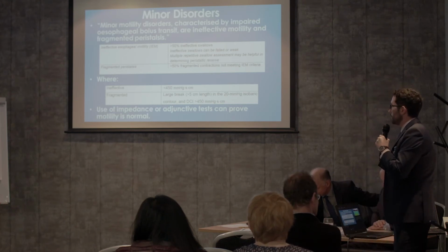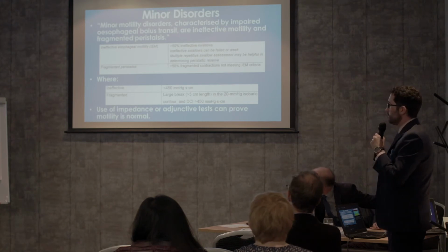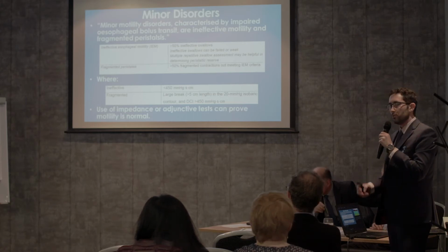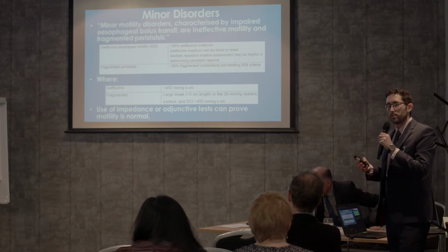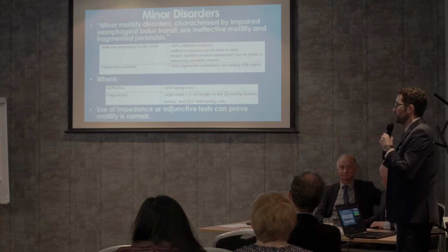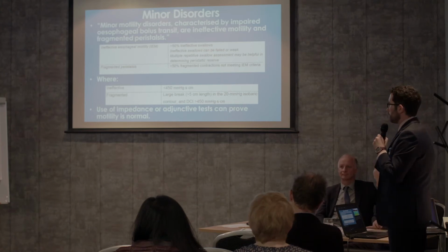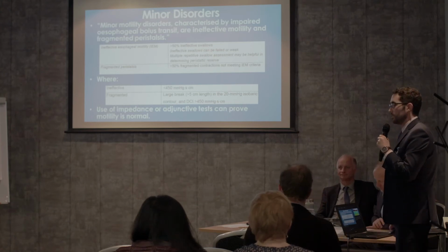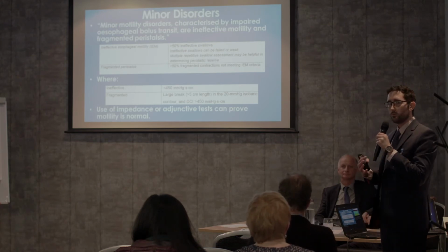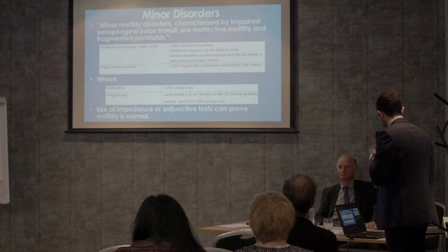The term ineffective comes from that statement there, impaired bolus transit. Essentially the idea is that in swallows less than 450, there was an increased chance that you would get bolus escape or poor clearance. However, overall, it's potentially not the best way to describe the motility. The problem is if you're sending that back to the referrer and telling them it's ineffective, you've got to ask yourself, is that really a good description of what you're seeing? So there are a few ways you can get around this.